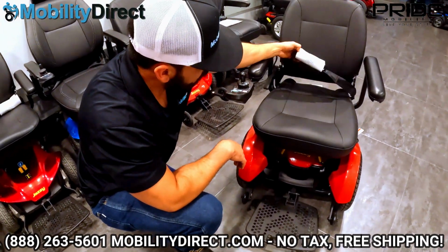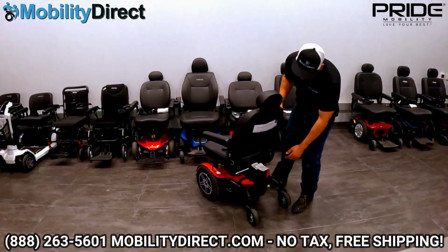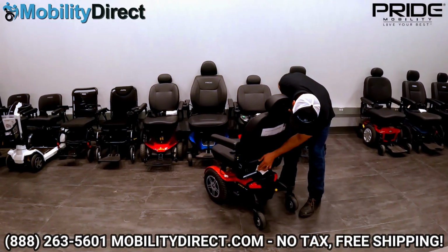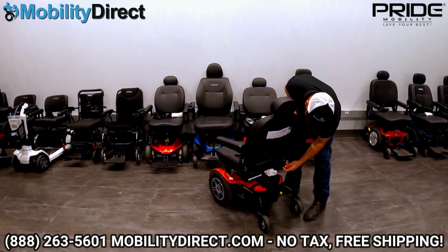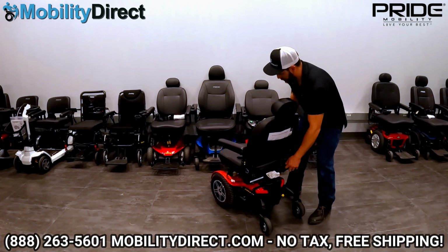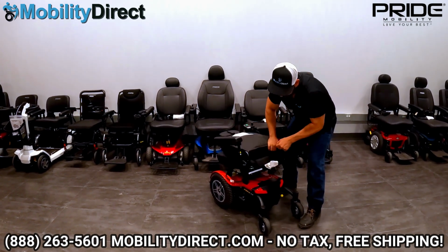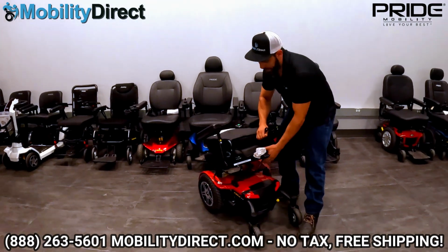Comes with a seat belt. You have several different size options for the seat belt. You can actually remove the seat. Just pull on this lever, or on this strap rather, right here, and it's going to disconnect the clamp. You should actually fold the backrest down first. Pull this lever, and now you can raise the back of the seat up.